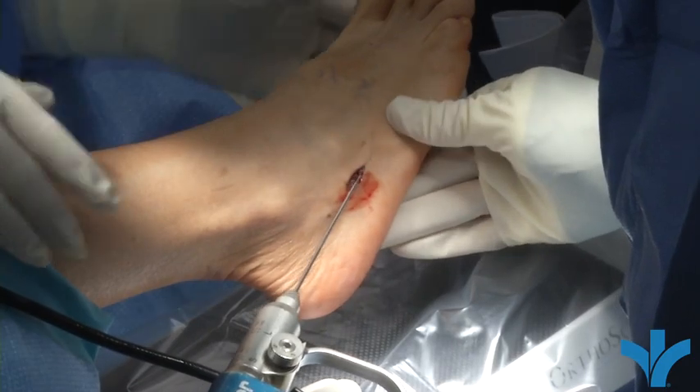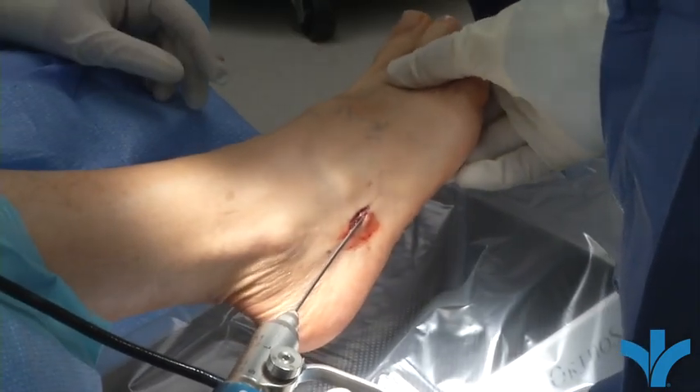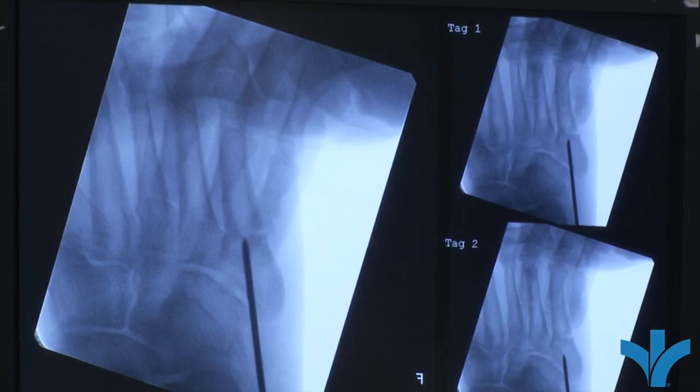Sometimes there's a tough area to drill through right here because the bone gets really dense where it's tried to heal itself. So you almost have to drill through it.